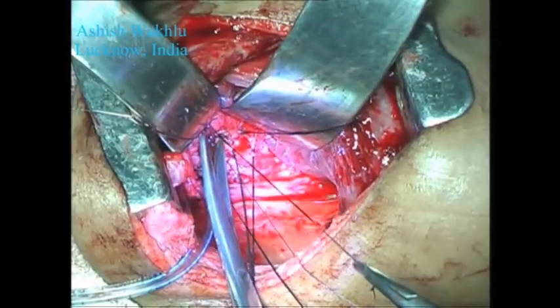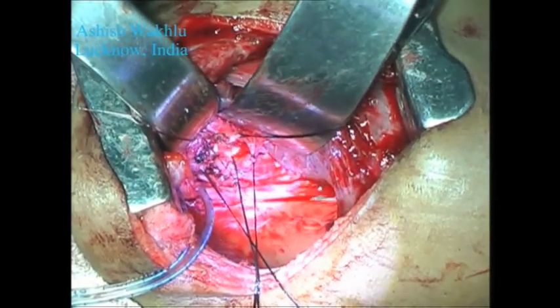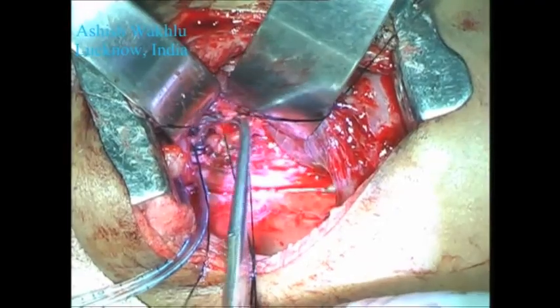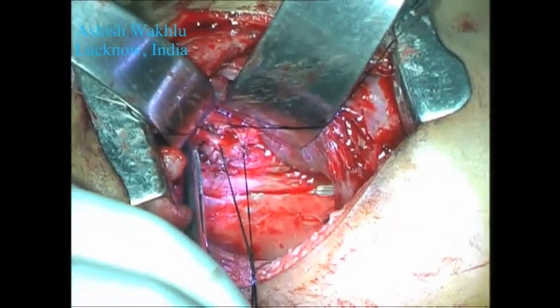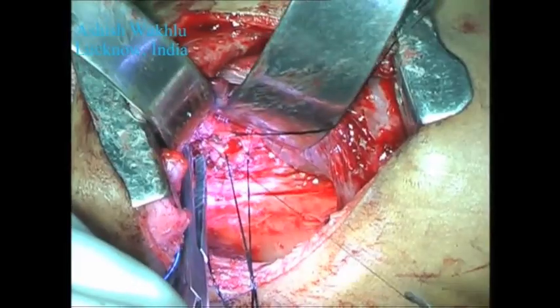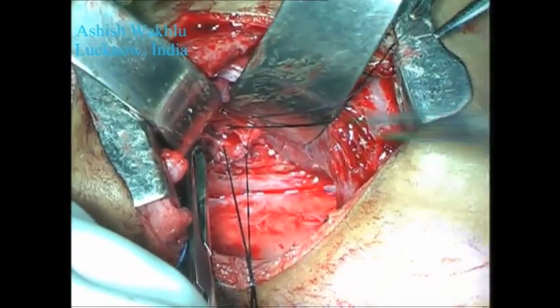As you can see, due to the short length of the bronchial stump, the space to operate is rather limited here, but the two lumens can be seen to be getting approximated. One feature which helps is not to keep an excessive amount of stay sutures in the operative field, otherwise one is continuously trying to work around them while getting the sutures in for the anastomosis.